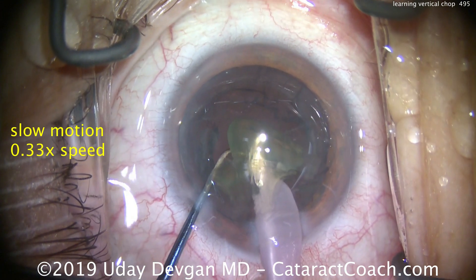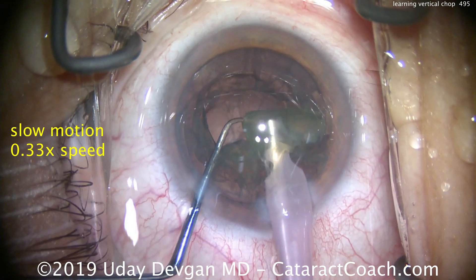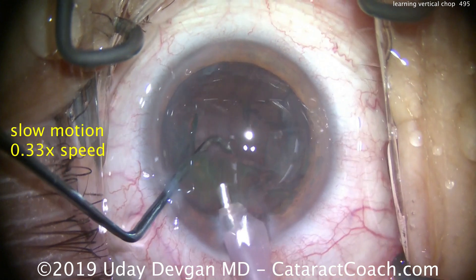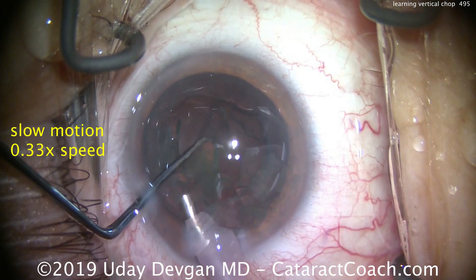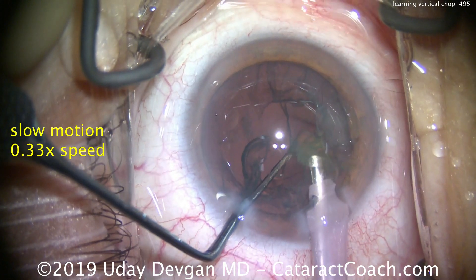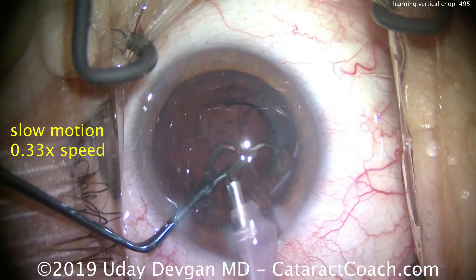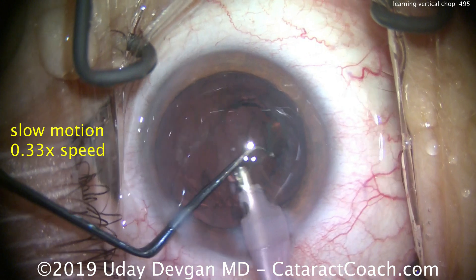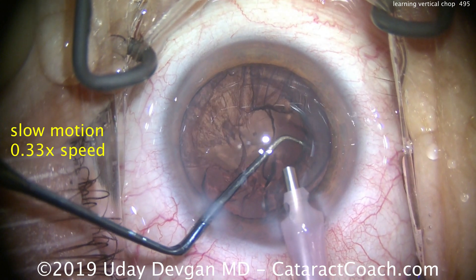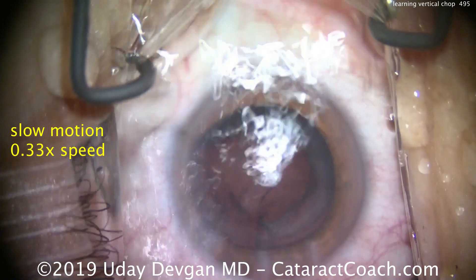The key in a vertical chop is that both instruments are inside — inside the capsulorhexis. You don't have to place the chopper around the lens equator. The phaco probe is just inside the temporal sub-incisional area, just inside that edge of the rhexis, aiming the probe deep towards the optic nerve. The chopper goes in just inside the nasal capsulorhexis and is dug in relatively deep into the nucleus. The instruments are then slightly brought together, then pulled apart to create the cleavage plane, which you propagate and complete through the entire nucleus.